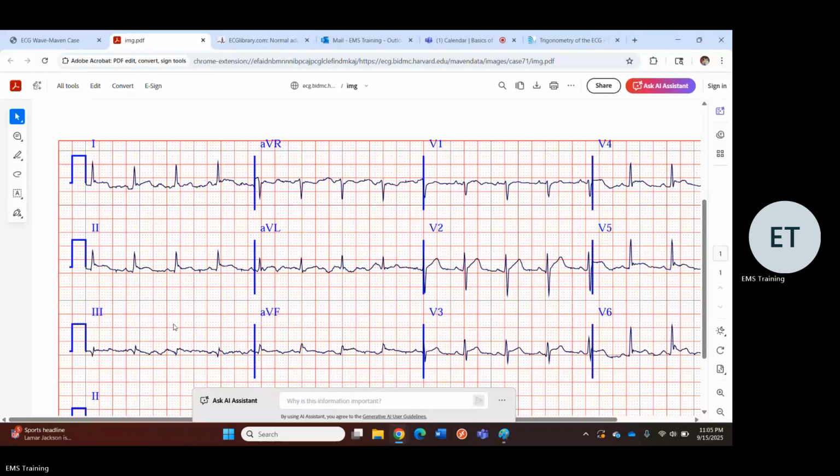Not rheumatic disease, pericarditis. Yep. Pericarditis. Oh man, I don't know. These T waves here do look kind of big though. Not excessively big. This ST elevation right here does look concerning. I will admit that. Even with the PR depression, that looks like ST elevation.